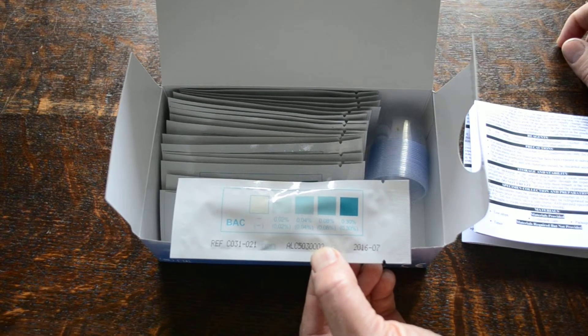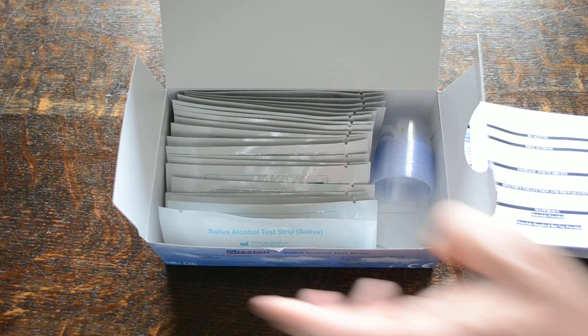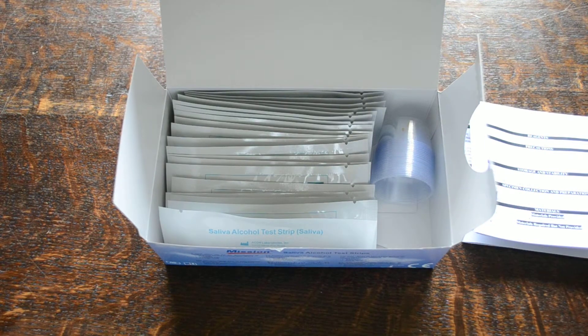By matching the color pad change on those test strips, you can determine the blood alcohol levels at the time of testing.